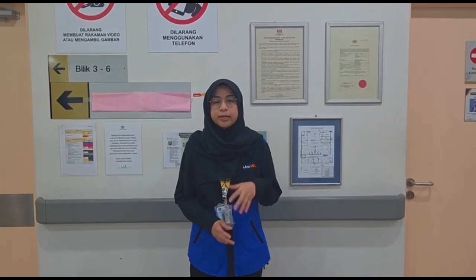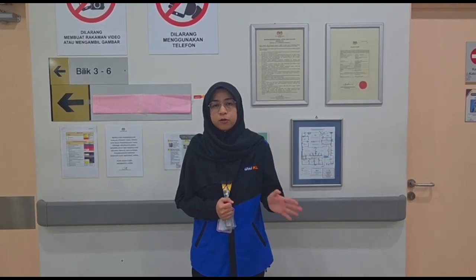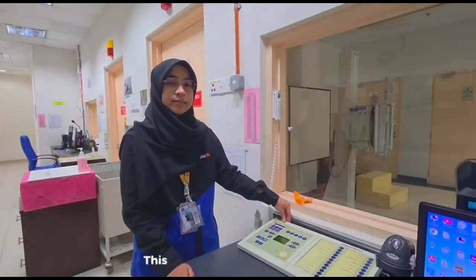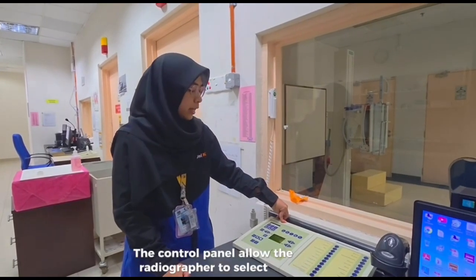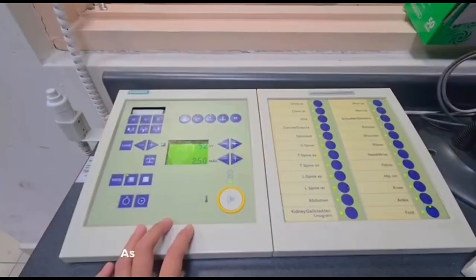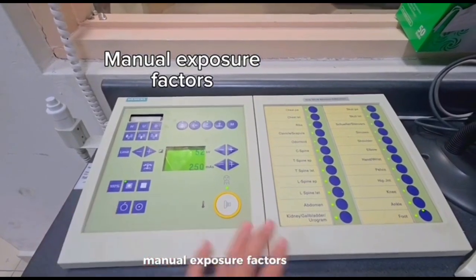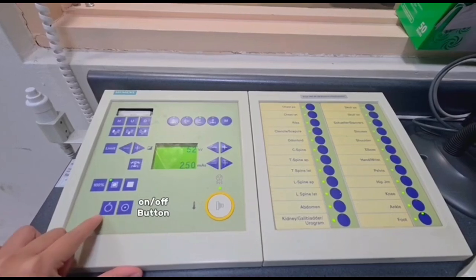Assalamualaikum and hi, my name is Mira binti Abdul Aziz, and for my part, I will explain about the main controls on the control panel of the CR X-ray system. Okay, this is the control panel. The control panel allows the radiographer to select exposure factors and the examination program. As we can see, on the left side is the manual exposure factors, and on the right side is the examination program. Okay, this is the on-off button.